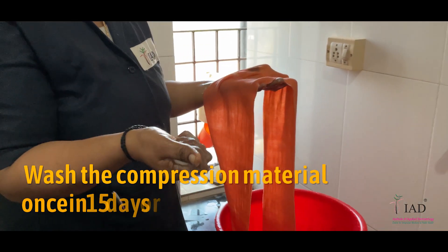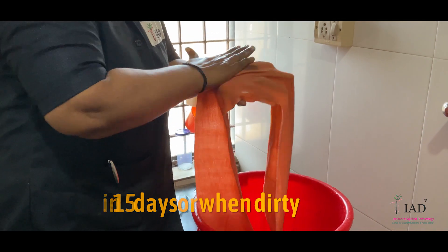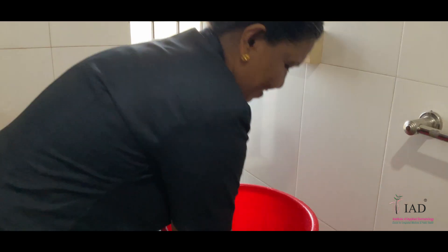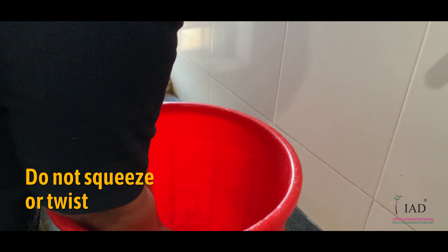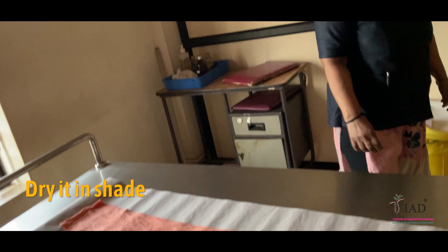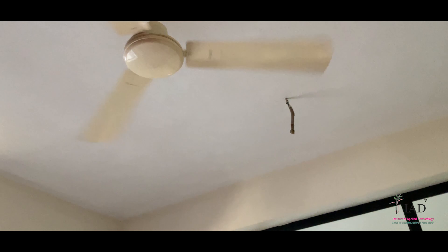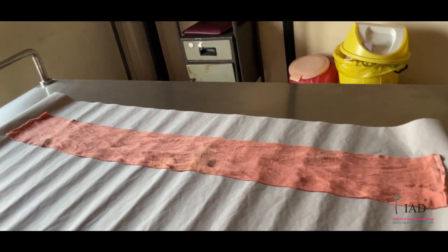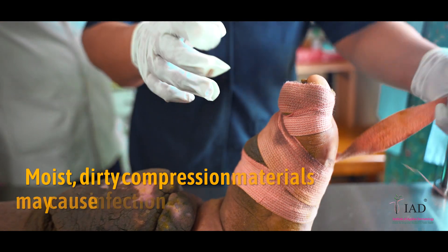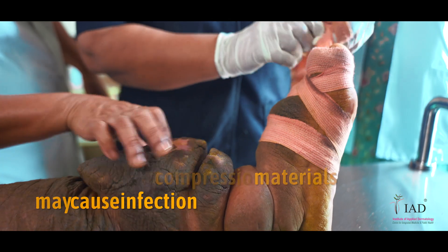Wash the compression material once in 15 days or whenever it becomes dirty, in normal tap water with bathing soap. Do not squeeze or twist the compression material. Dry it in shade or under a fan by keeping it over a newspaper on the floor. In this way, you can use the same bandage material repeatedly for almost a month. Do not use moist or dirty compression materials as they may cause secondary infections.